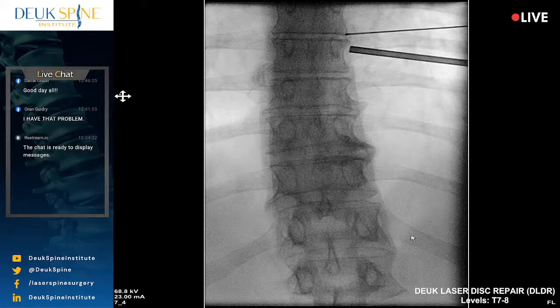It really doesn't attach to the pedicle, it just looks like it on AP view, but that's the T12 rib because you can look below that and there is no more rib, and there's just a transverse process. So that transverse process is just the lumbar spine, basically. So that's L1. So we know we can count up from T12 by counting the ribs and the pedicles, and we know we're at T7-8.